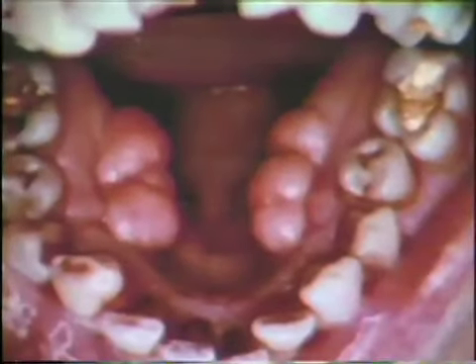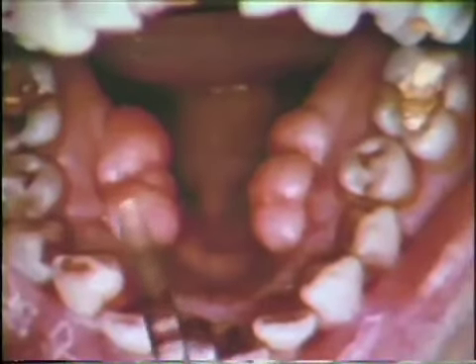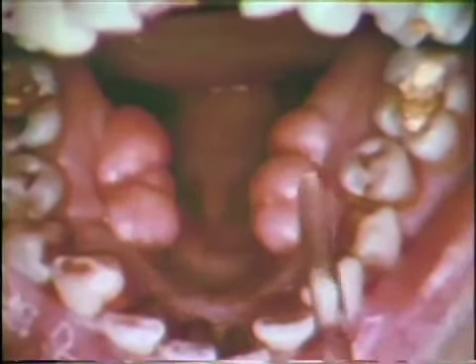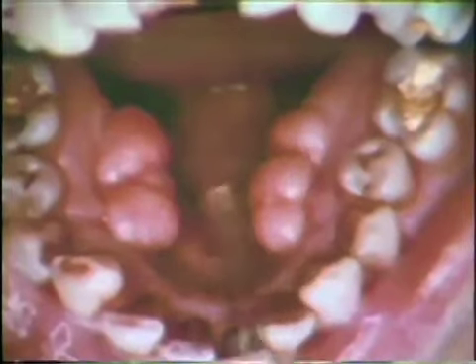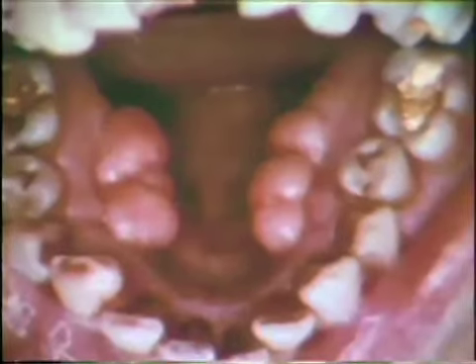In the lower jaw of another individual, a third example of an obstacle is noted. This is also a benign bony growth. It is not uncommon, usually occurs on both sides, and is called a torus mandibularis. The film must be placed on the lingual side of the torus when radiographing the patient's teeth. Care must be taken not to bruise the growth.